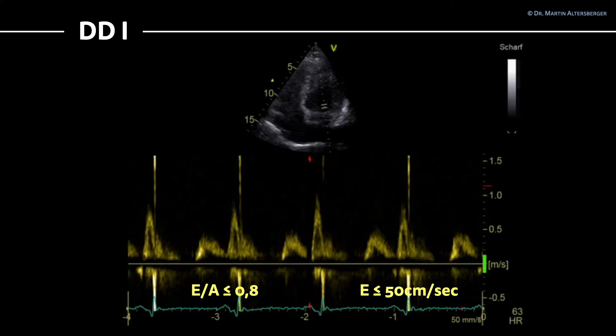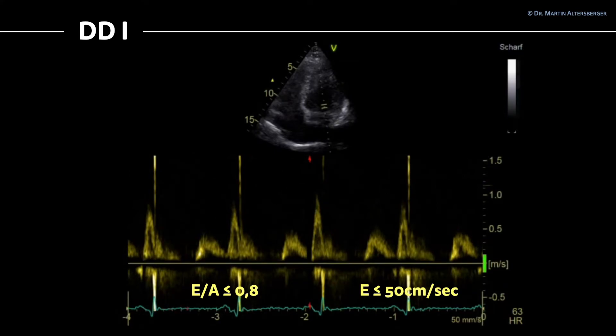You can see it here — it's just a little bit below 50 centimeters per second, with a rather small E wave and a rather large A wave. This is already diastolic dysfunction grade 1.